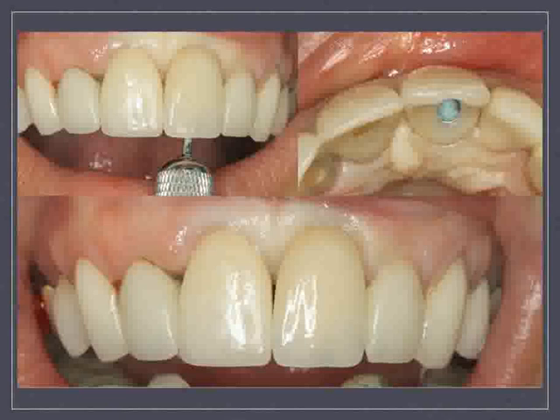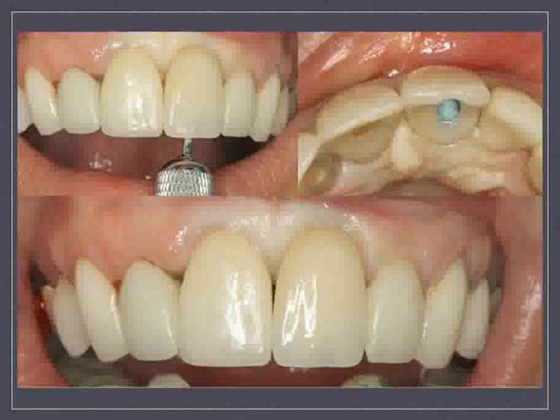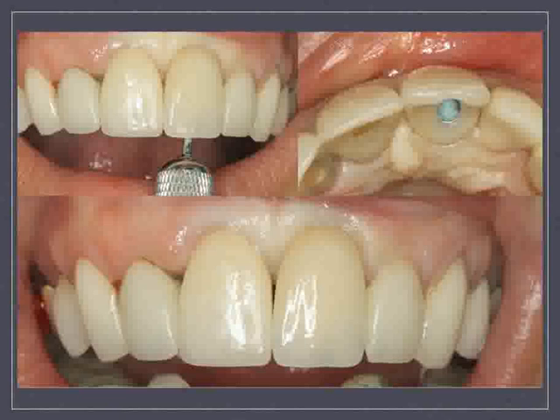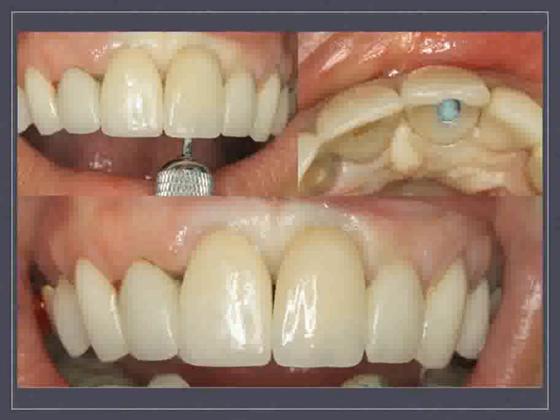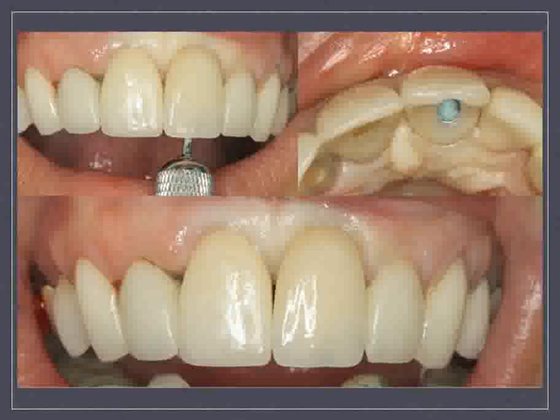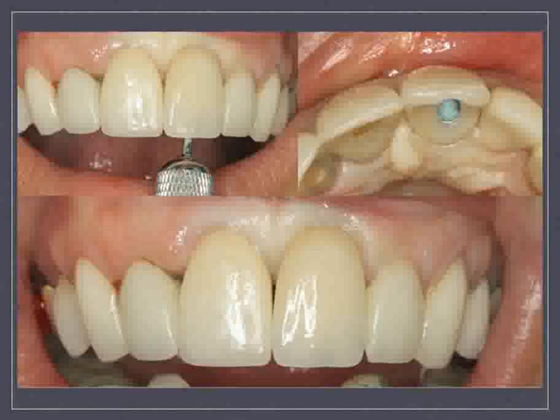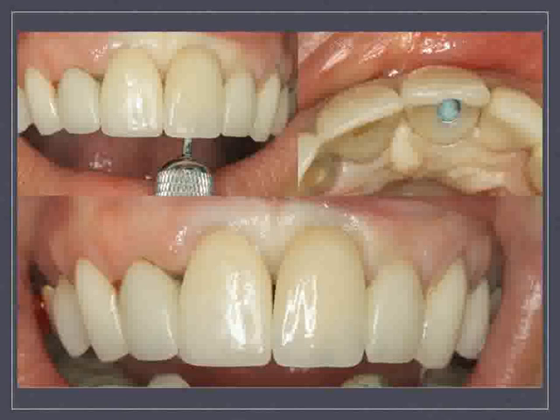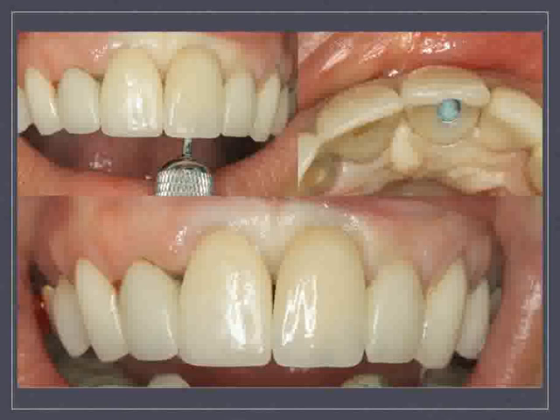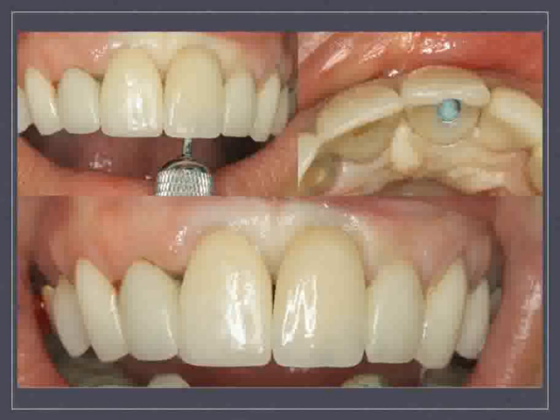This case was sent to us from an awesome dentist in California, August de Oliveira. He has done a lot of work in the CAD world with dental implants and runs a company called Implants Made Easy. You can find him on Facebook or Google. He's a tremendous educator and clinician. This is a quick demonstration of those prior images at completion. This happened to be a screw-retained prosthesis. From the top right image, there's an access hole that August screwed in place, sealed with a little composite, giving a beautifully made custom hybrid abutment Emax crown, all in one piece, screw retained.